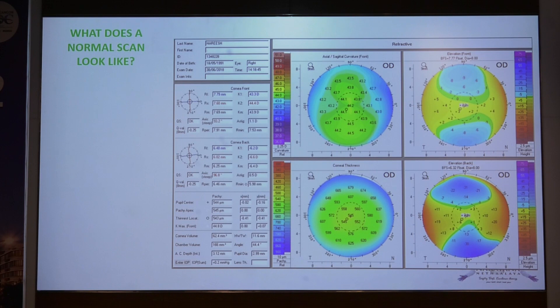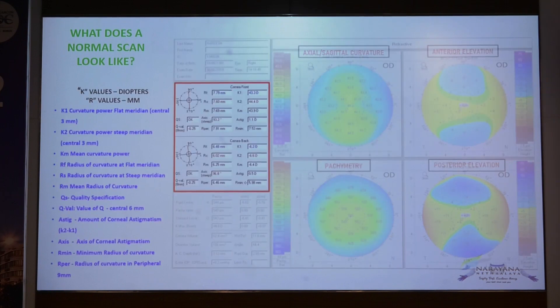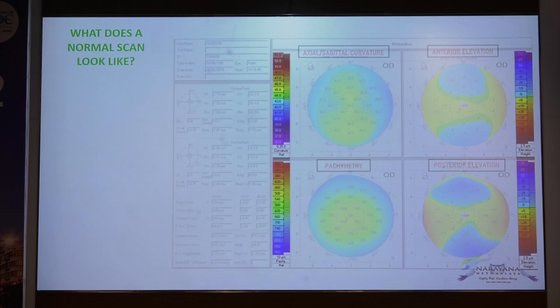A normal scan gives us the axial curvature, anterior elevation, posterior elevation, and the pachymetric map. On the left-hand side are all the indices required to read the map and evaluate whether the map is normal, suspicious, or abnormal. The scales are very important — it can be a normalized or a standardized scale. The standardized or absolute scale has a fixed dioptric increment and helps in comparing scans, whereas with a normalized scale, we can change the dioptric increments.